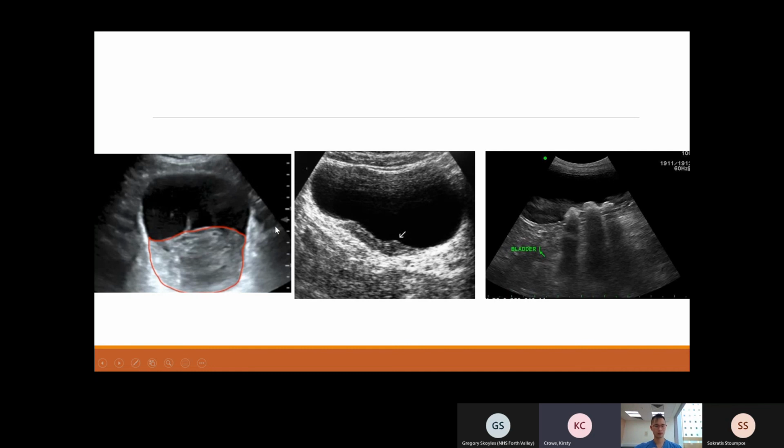I'm not sure what that is. It looks like it's sort of something growing out from the bladder wall. There's hyperacoustic shadowing under it though. I don't know what it is. Okay, so this is actually the whole bladder. Within the bladder is this collection. Oh right, okay. So is it kind of like a pus collection or something? I don't know. Well, yeah, it could be.